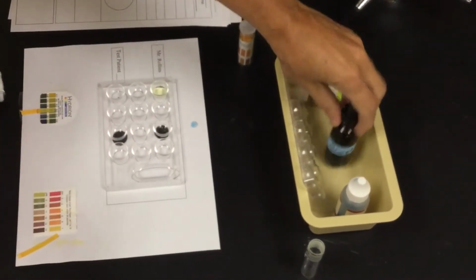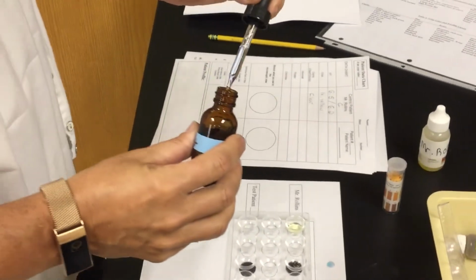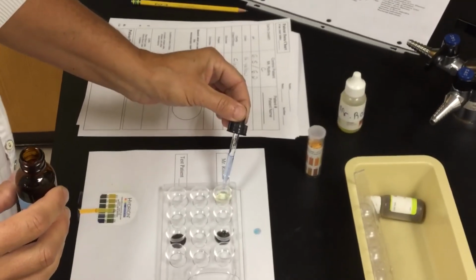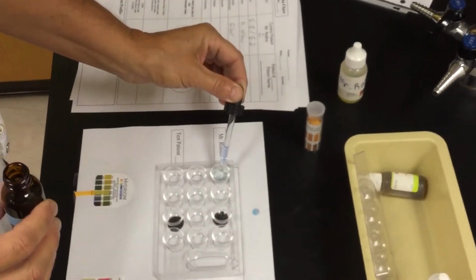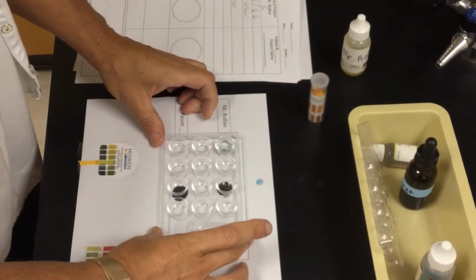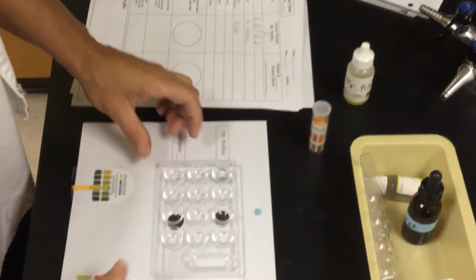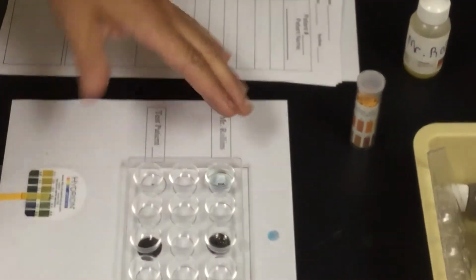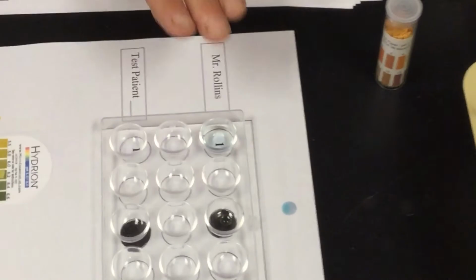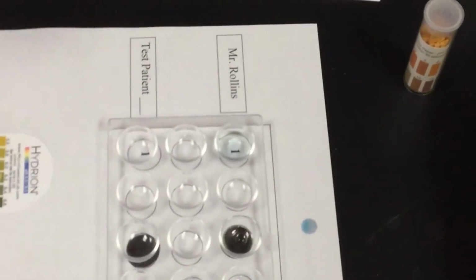My next one is going to be for protein. If you guys remember Biuret solution from first year bio, that's what we use to test proteins. So I'm going to go through 1, 2, 3, 4, 5, and what I'm looking for is a kind of a chemical change there, and we want it to turn more of a pinkish or purple color. Okay, so we can kind of see it's just this bluish color right now. However, we want this to sit for about 3 minutes as well. So by the time I pull that glucose tube out of the hot water, my protein should be done.